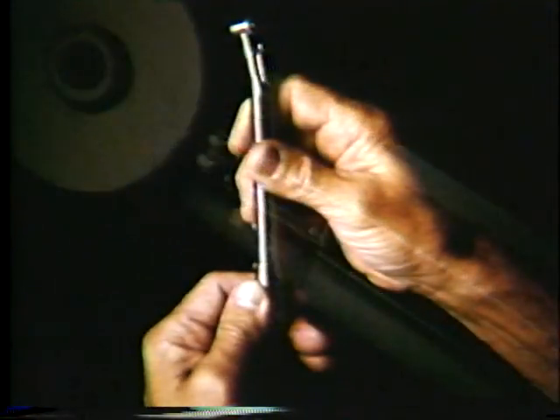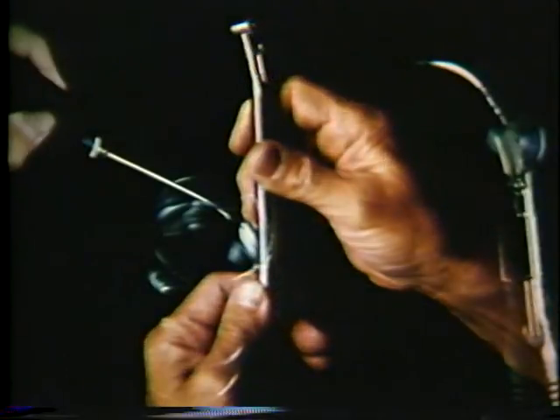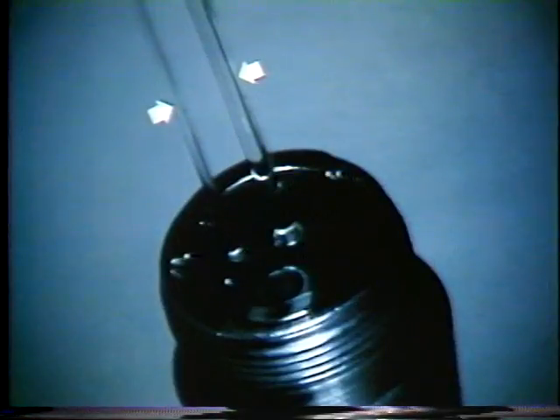If the spray clips are clogged, they'll have to be cleaned too. Disconnect the black hose. Fill the chip blower with water and put a small piece of neoprene tubing over both the air and water tubes on the spray clip. Squeeze the chip blower and the water will run through the handpiece. The water should come out the smaller two holes in the back of the handpiece. There should be two distinct streams of water if both the air and water sprays are clean.